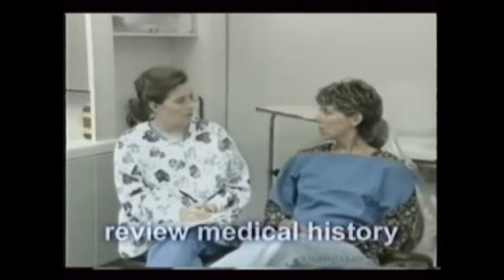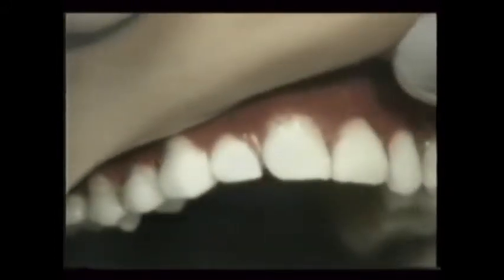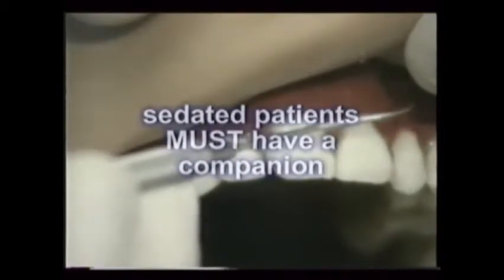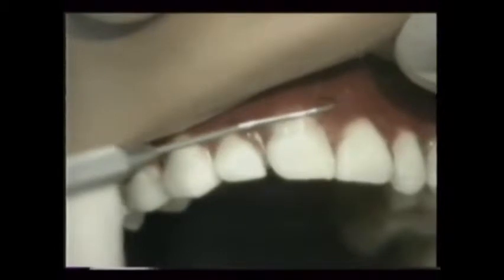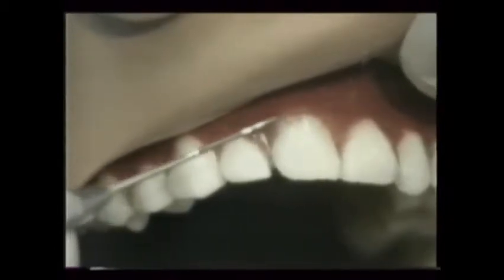Surgery begins with the usual review of the medical history and proper patient preparation. Once they're seated and the needed instruments are gathered and left covered from view for patient peace of mind, you may put on your mask, gloves, and protective eyewear. Many periodontal patients are sedated before surgery and must have a companion to drive them home. After the local anesthetic has been administered and allowed to take effect, surgery may begin.